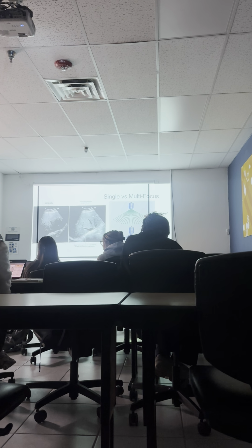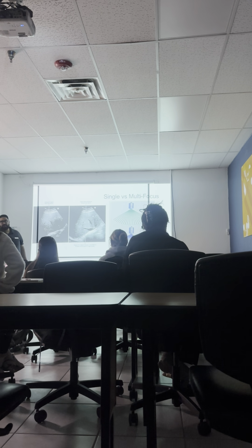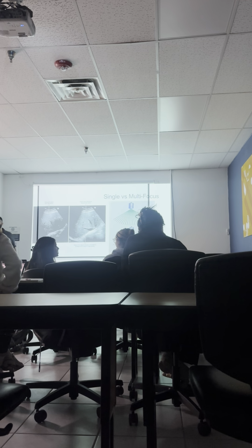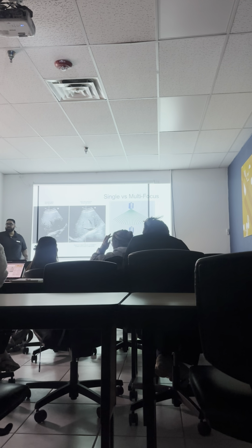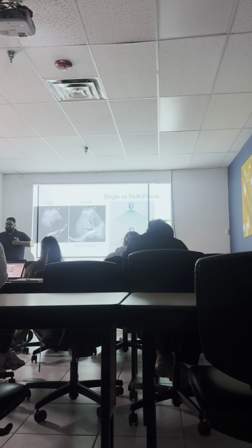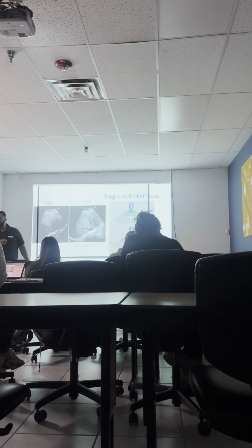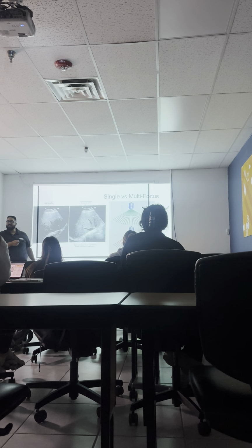The only thing is the heart. I know why. Okay, so we're not worried too much about lateral resolution for the heart, because there's multiple factors. Okay, so where is your heart in your body? Your left side and your chest. Point to upper chest. Here, right? So if I were to take this thing and stab myself with it, would I be able to hit my heart? Yeah, most likely, right? So we can say that the heart is very superficial. Okay, so there's less distance it needs to travel, which means what?